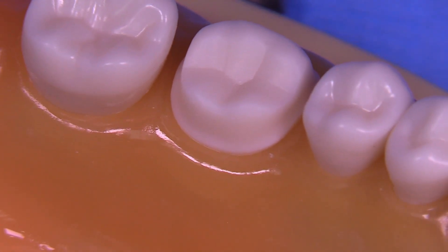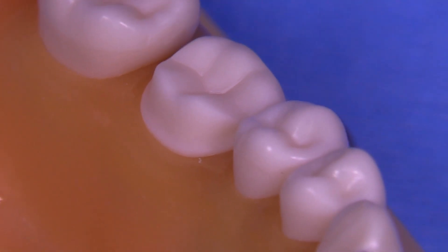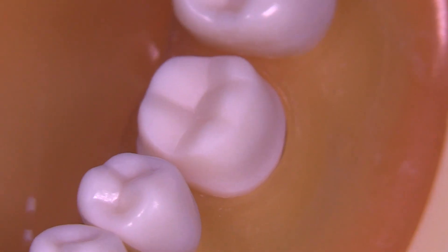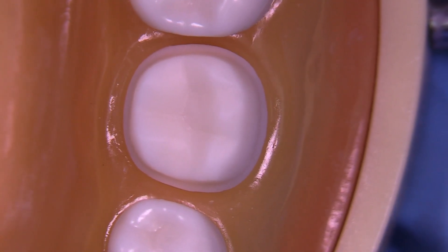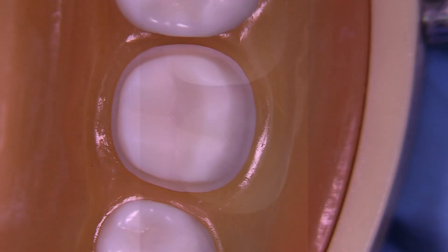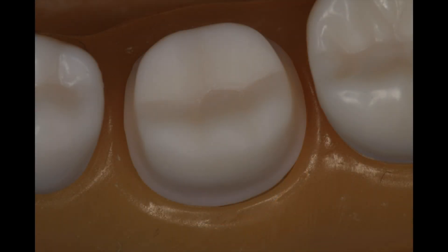You want to be somewhere between 1.2 and 1.8 millimeters of occlusal clearance, which will make this typodont tooth a little bit short because it is a shorter tooth to begin with. Anyway, those are the final results. I appreciate you watching this short video on the full gold crown, and I hope you stay tuned for more videos. Let me know what you think in the comments.